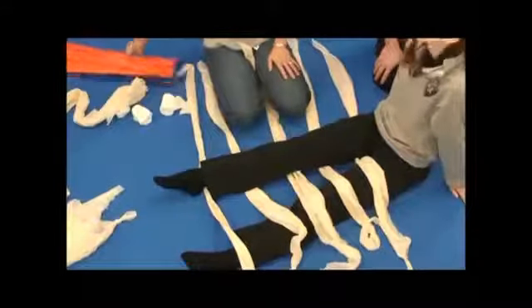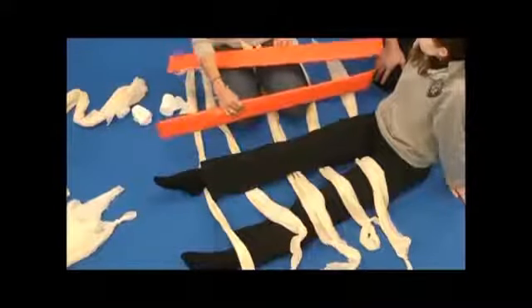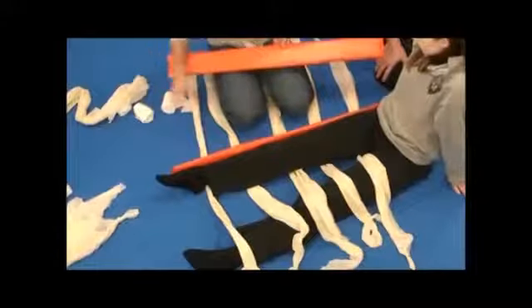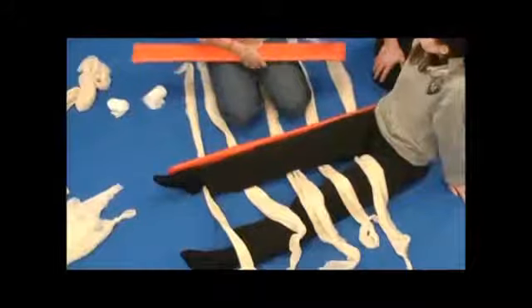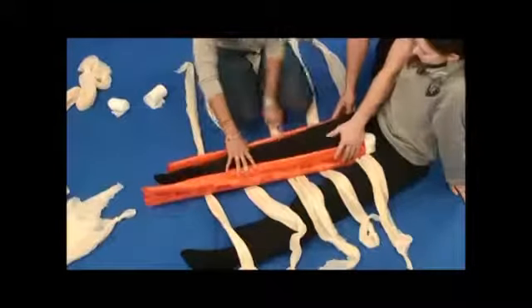Now that we have that in place, we're going to use our padded board splints — the medium size, because our patient's leg is shorter. If we had a seven-foot-tall patient, we'd obviously need the larger board splints. I'm going to apply these to either side. The one going on the inner part of the leg, you may need to pad just for comfort for your patient. If you'll hold that there.